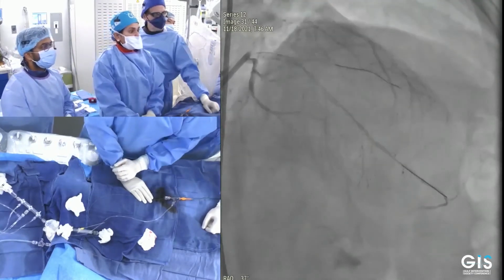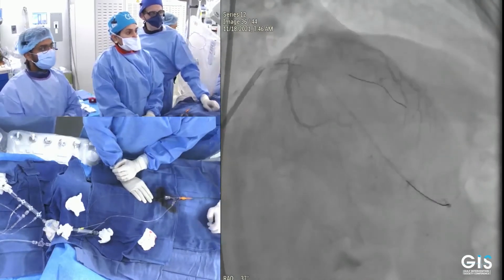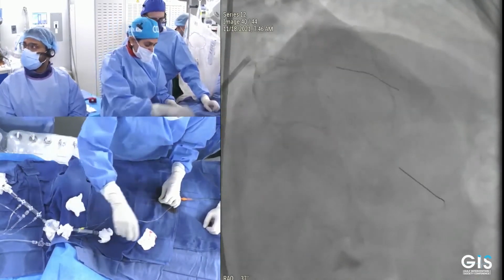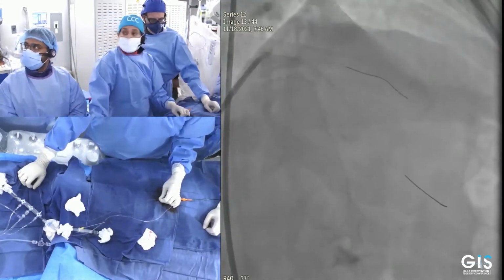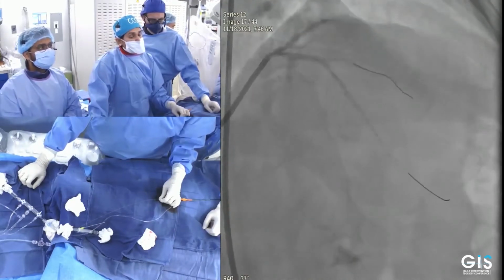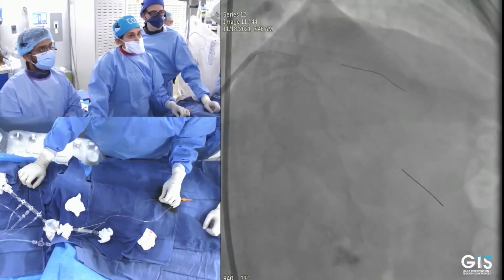Dr. Subhi, if you allow me. So I think for the side branch, this is to me 1-1-0. I would not image the side branch. With the pullback from the OCT, you can see a very patent, healthy side branch. And also after the high pressure NC balloon, the vessel is clearly patent. So I think this is by all means a provisional to start with. So stepwise provisional rather than just provisional. But we have learned to be ready to be dynamic, depending on what we find.